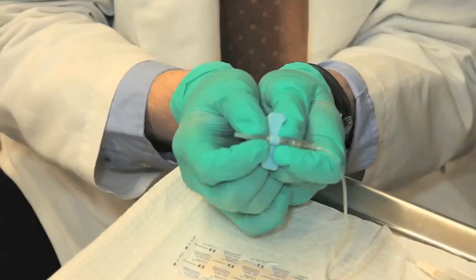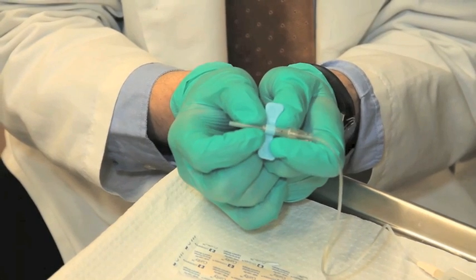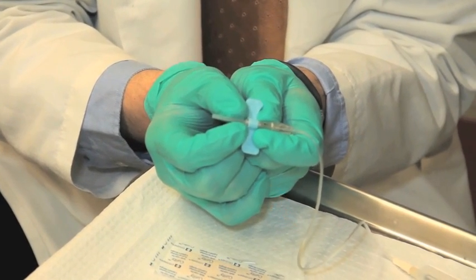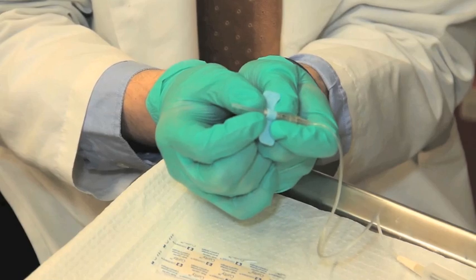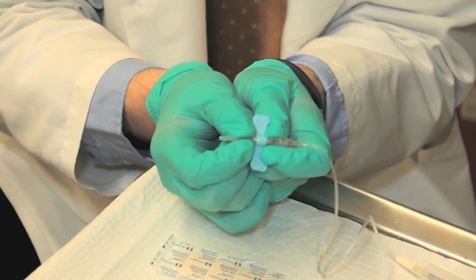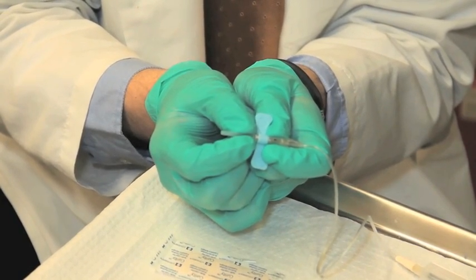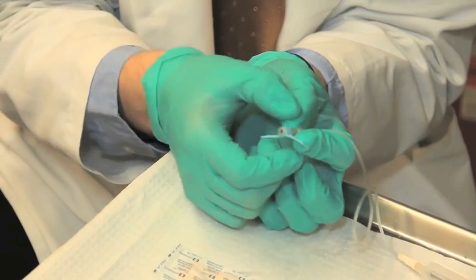Continue by uncapping the needle. To do this, hold the base of the needle in one hand and the cap with the other. I've hooked my fingers together so I can dorsiflex these fingers while preventing excess displacement of my hands upon giving the cap. I feel a click or snap that the cap was removed and then it slides off effortlessly.